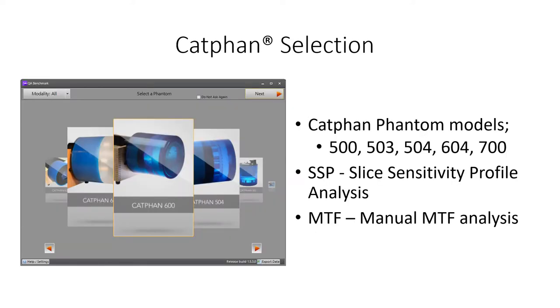The main application screen for AutoQA Plus displays all the CatPhan models supported along with selection options for SSP, slice sensitivity profile, and a standalone MTF measurement function. The user selects a phantom and clicks next to advance. The screen can be disabled on startup, but if needed, can be accessed using the back button at the next screen.